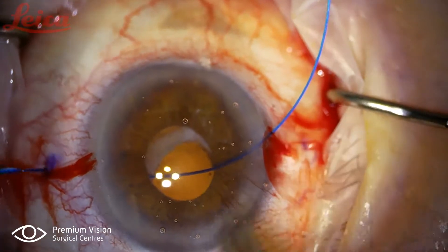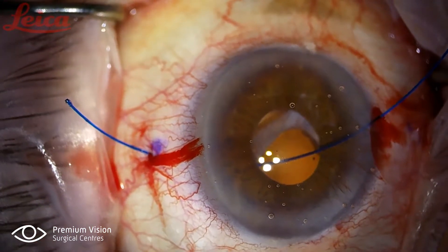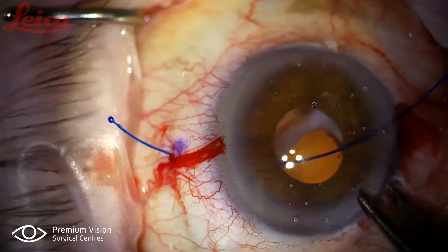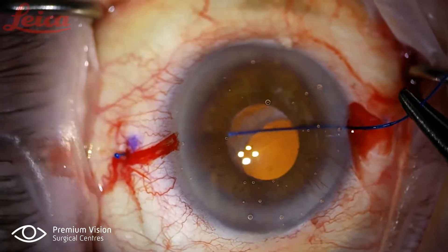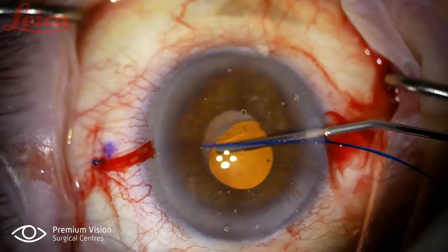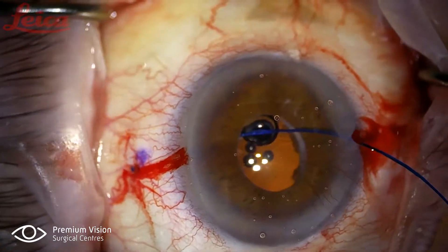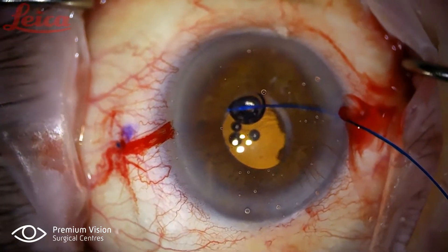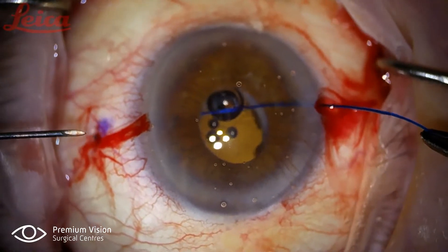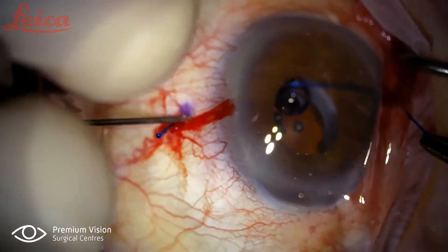I'm pulling back and pulling the Prolean suture with it, holding it with the needle holder, and then we'll create a small flange on the tip — don't make it too big, try to make it as flat as possible so it doesn't irritate the patient later. Then tuck it back in and make sure it stays in, because the path of the 30-gauge needle is smaller than the 27-gauge needle. Now I'm creating a little more space with viscoelastic between the lens because the second pass will be just behind the iris, between the iris and the capsule tension ring and lens complex.